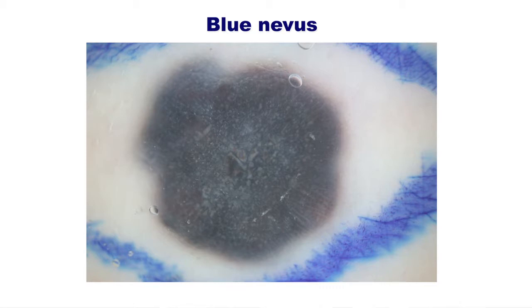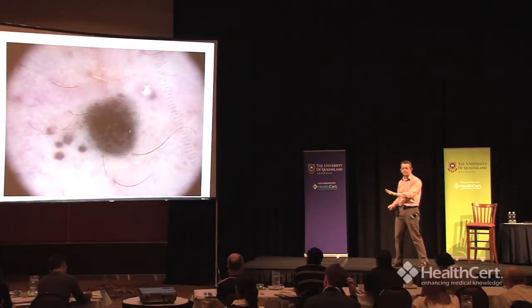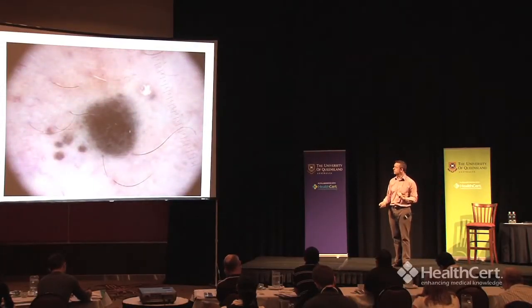They've got this sort of slate color. And they're homogeneous. There are no blood vessels. There's no variation in color. That's a blue nevus. But here's also a blue nevus, but looks different. Suspicious with these extra little satellite lesions, right? Could easily be a melanoma, could be a melanoma deposit, could be a melanoma that's starting to spread and track through the skin. So unless the history is absolutely clear, then this one we treat as being suspicious.